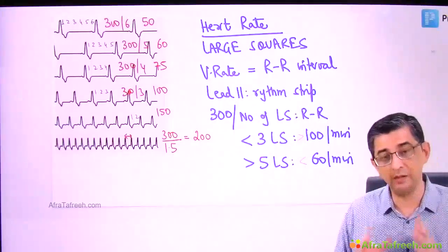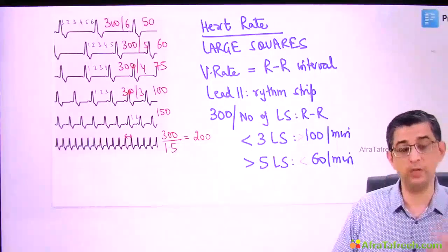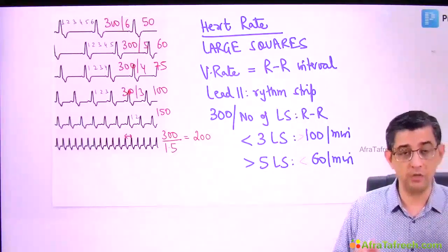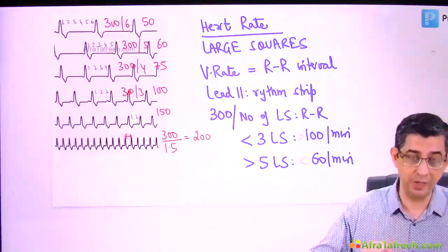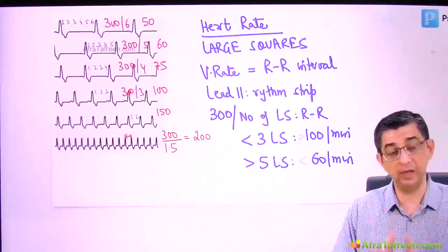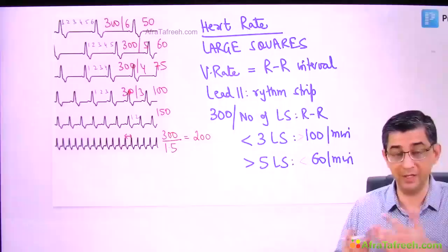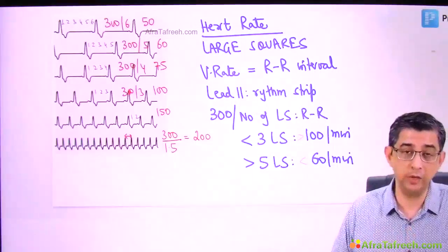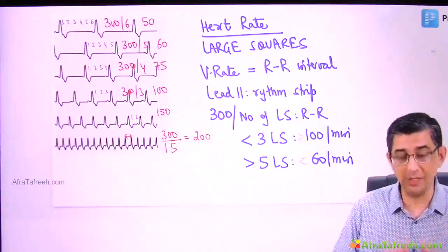And that should be right in the first 5 seconds of the ECG. And then subsequently, the next 5 seconds are to be invested for axis calculation. So now I'm going to teach you how to evaluate the axis. We'll go stepwise, 5 seconds for each step. It's heart rate, then axis. Then we look at the P wave, we look at the height and the duration. Then subsequently, whether the P wave is followed by a QRS complex. Is there a normal sinus rhythm? Is there a drop beat present in a patient? That comes with practice. But the first 10-second roadmap is mainly clear before you.